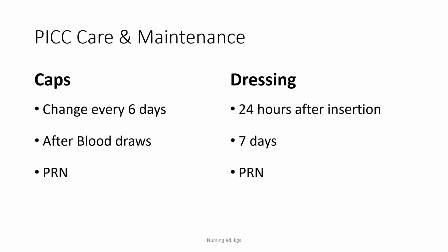So for PICC care and maintenance, caps are changed every 6 days, after blood draws or blood sampling, and PRN. Dressing changes: of course, you're going to be changing the dressing PRN if it is ever soiled or loose.